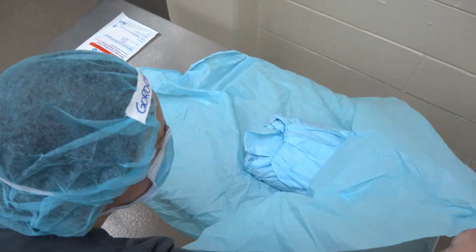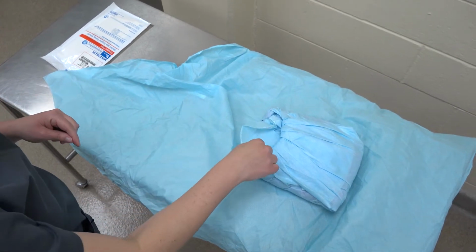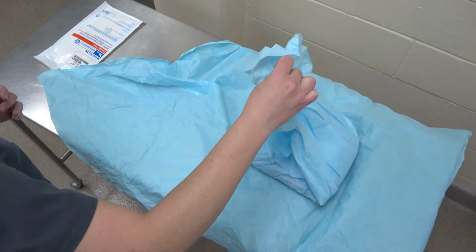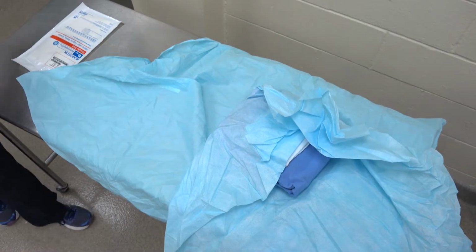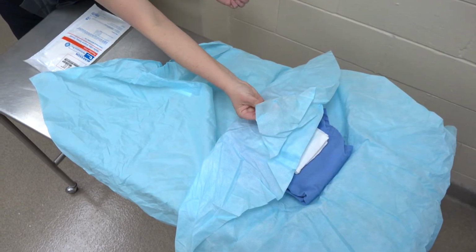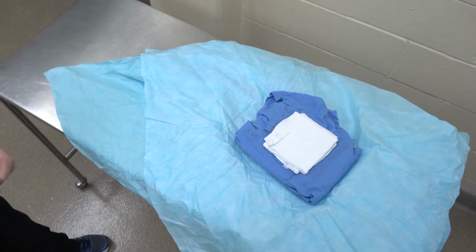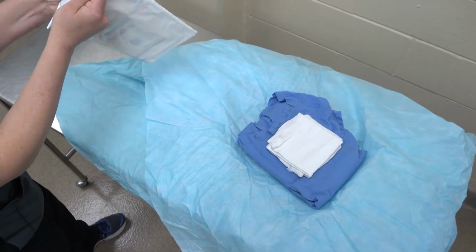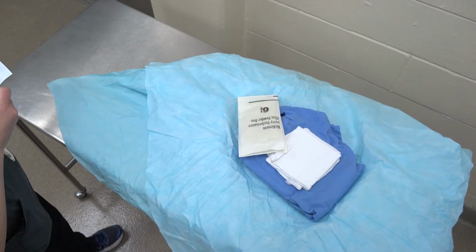Now, you'll notice on the instrument pack, we did not open the inside portion. This time, we are going to open the inside portion, because otherwise, how are you going to get to your towel when your hands are all wet? So again, I'm using the outside and edges as much as possible so that I don't get any contamination on the inside of this. All right, now our towel is facing up, and after we towel and put our gown on, we'll need our gloves. So what I'm going to do is open my gloves sterilely onto this field. Awesome. So now I'm all set and ready to scrub.